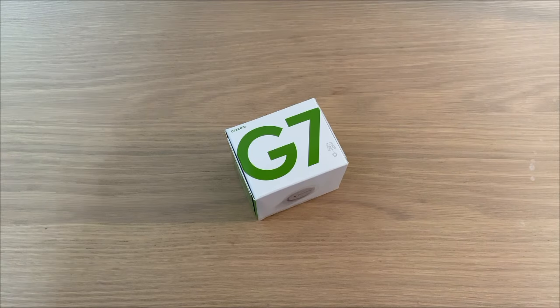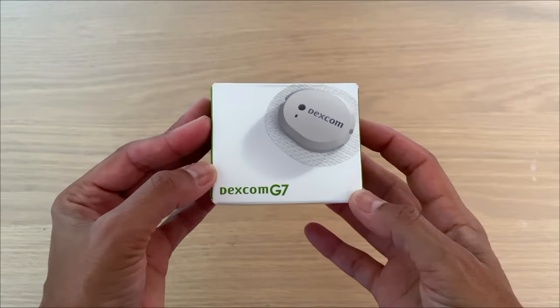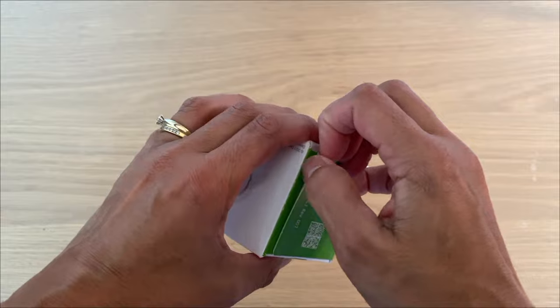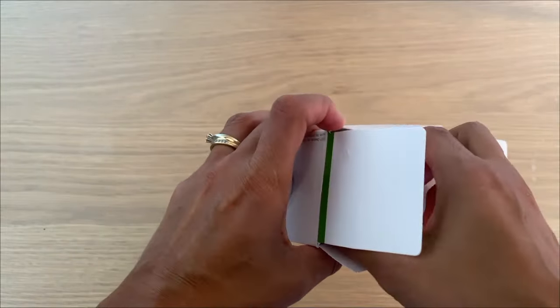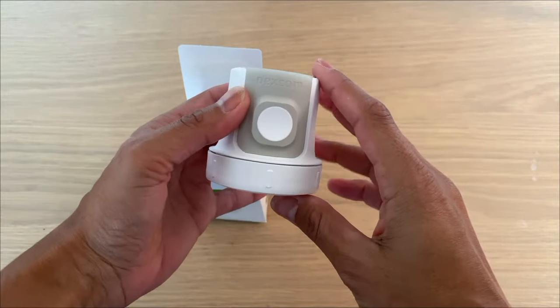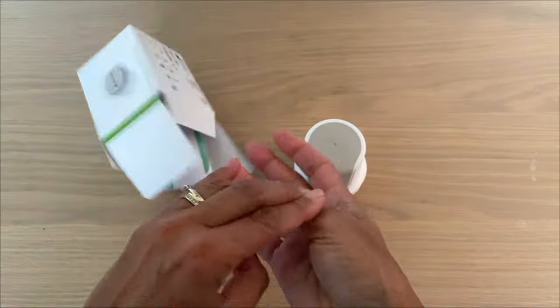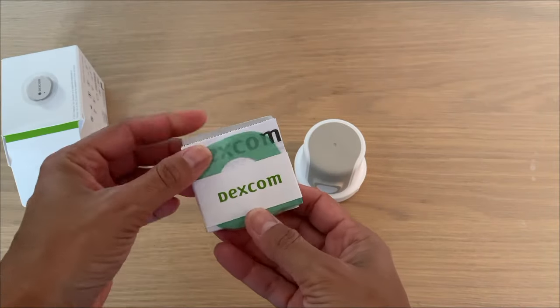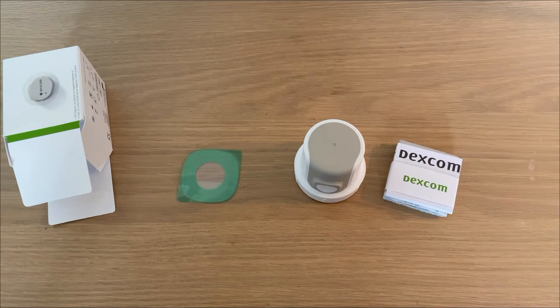Let's unpack the G7 together. It comes in this little box. When you pull it out, you'll see the sensor and inserter — all in one device. What you'll also find in the package is instructions as well as an overlay tape. Each sensor comes with an overlay tape, and that's all there is in the box.